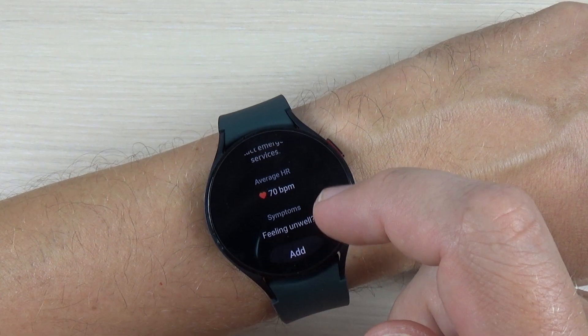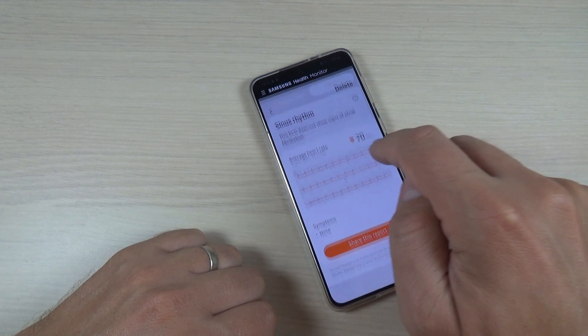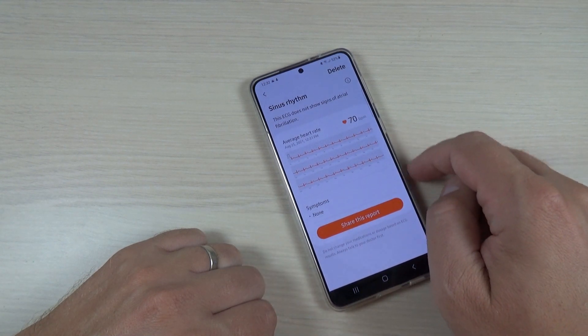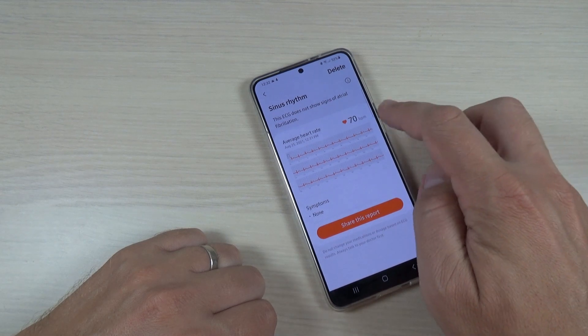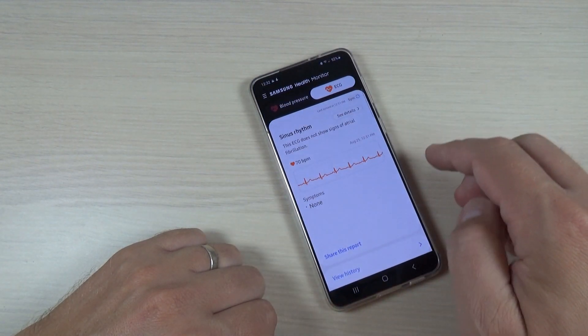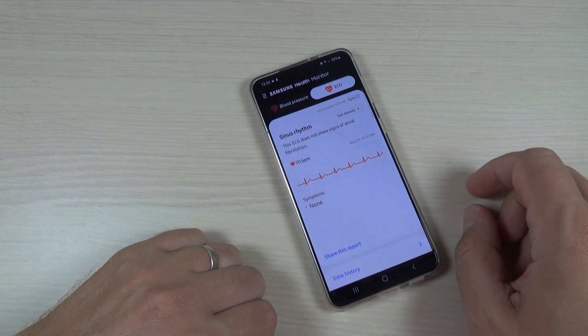Let's go back to my phone. This is the sinus rhythm and it's OK. The average heart rate is 70 bpm, and it seems that everything is fine because I don't have any symptoms.